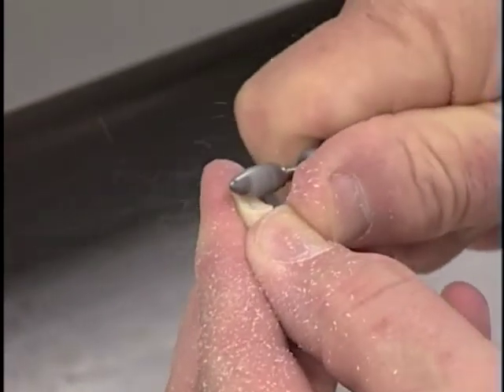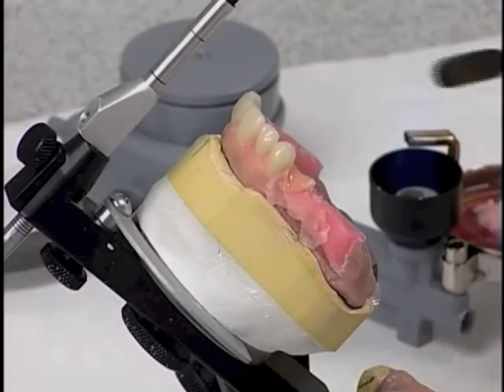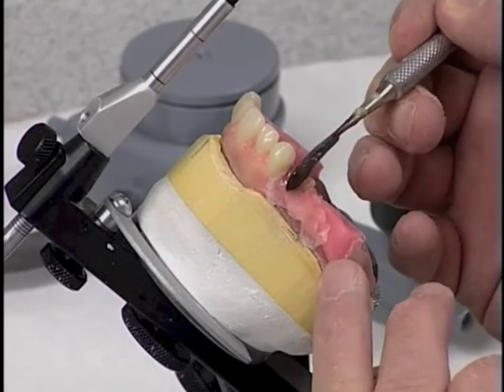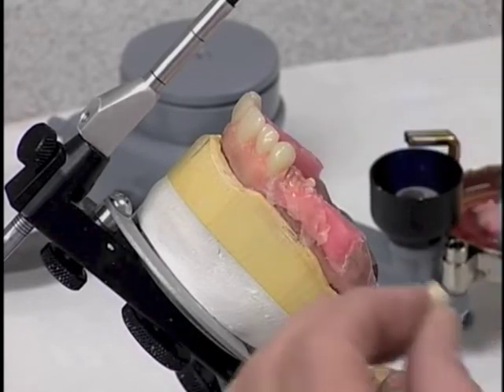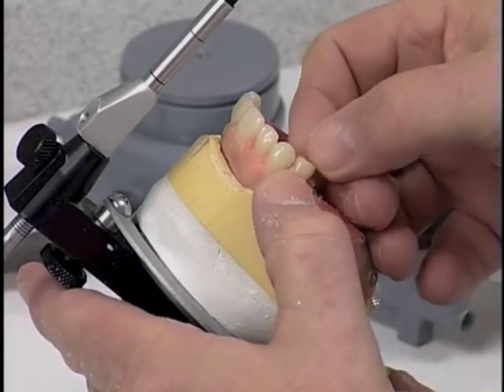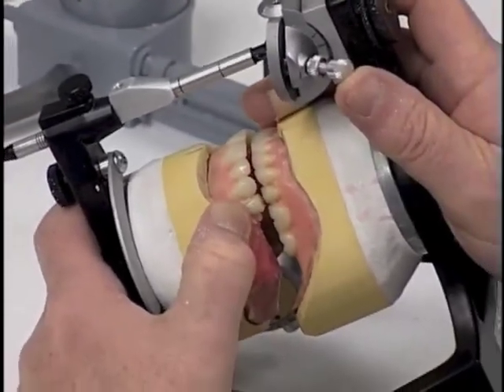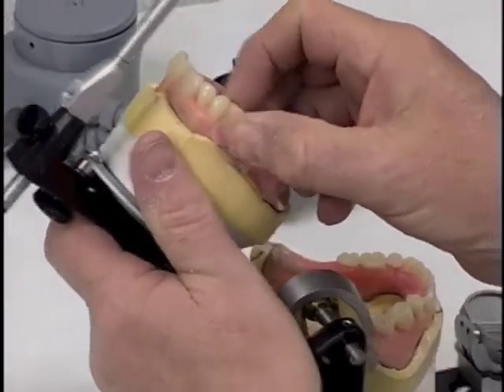And we trim the ridge lap of the tooth. Now that we've trimmed the tooth, we can go back to the articulator, pull the wax in the area where the tooth belongs, and hopefully now we can place the tooth without interference. So we gently place the tooth into the wax and close the articulator to see if we're getting a proper occlusion. It needs to go a little farther lingual than what I have it, just slightly.